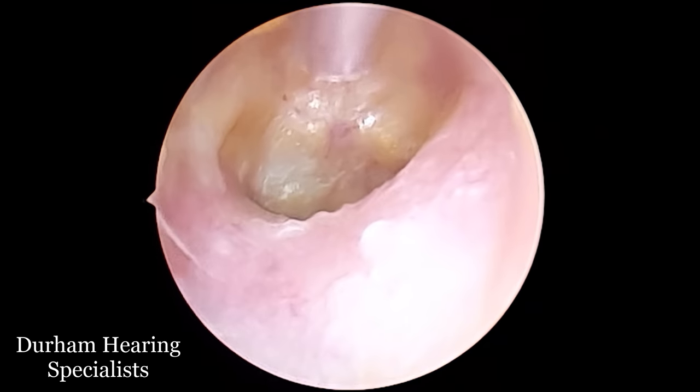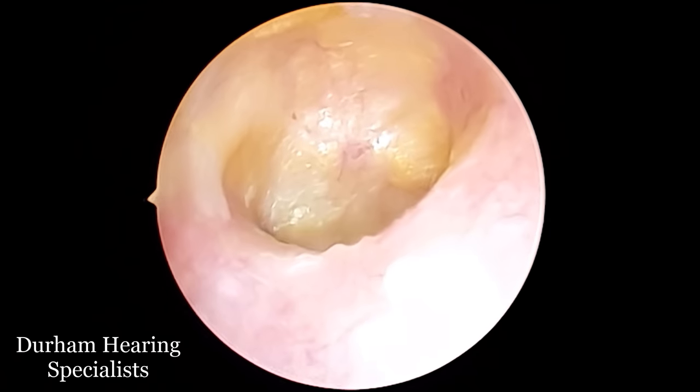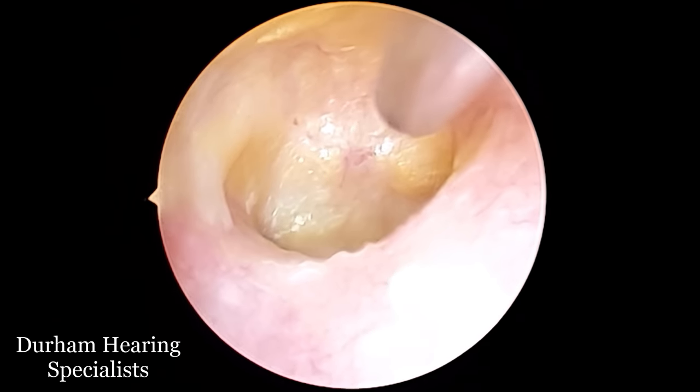What it is is a very thick layer of dead skin on the surface of the eardrum, which is trapping it essentially and stopping it from conducting sound. So this patient does have a hearing loss at present.